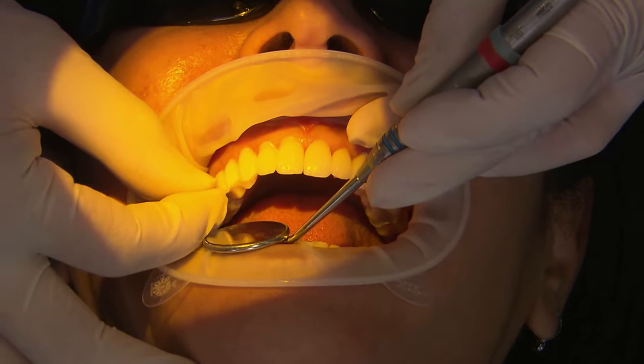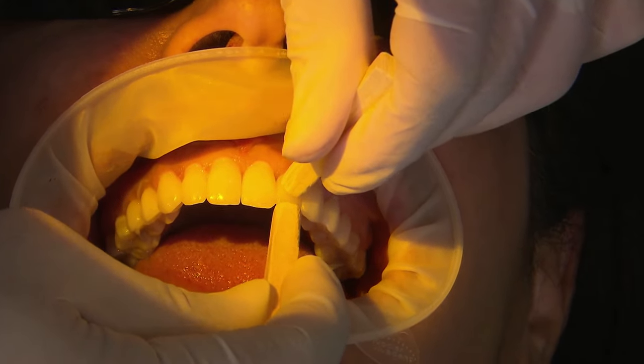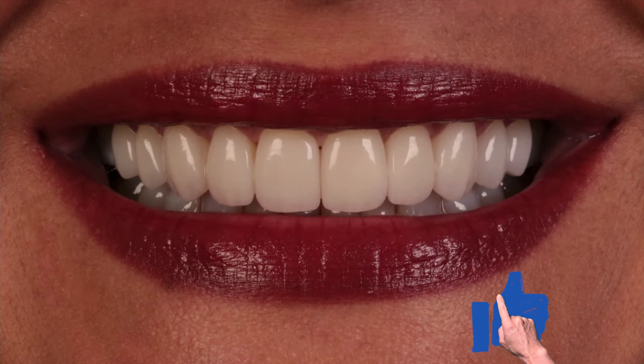Canines now, then the premolars. Once everything's down, I use these orange wood sticks. These restorations were in Bruxer Aesthetic — that's where our patient started, and these are the finals. It's always fun to see the transition on our patient from before and after.